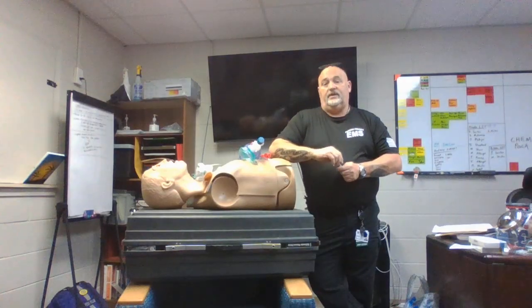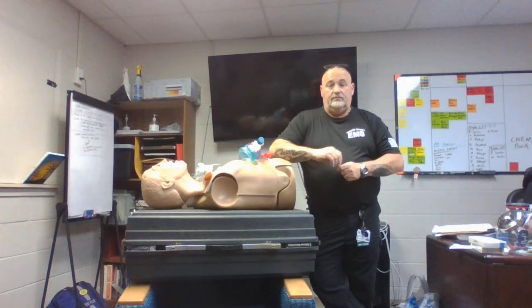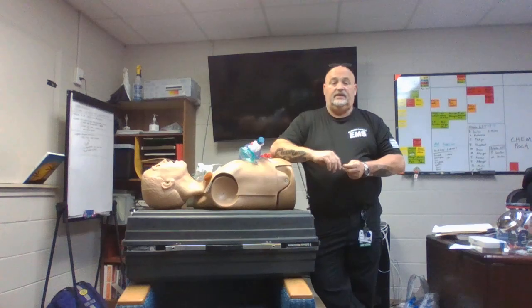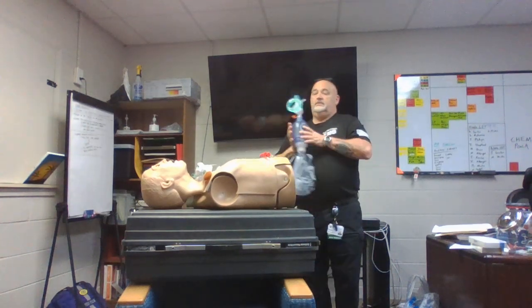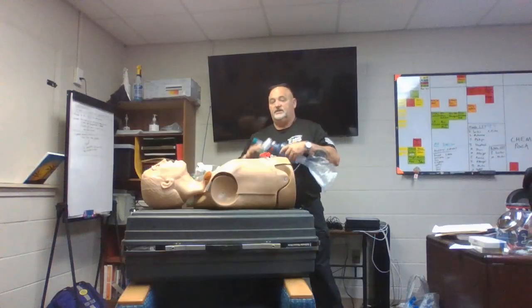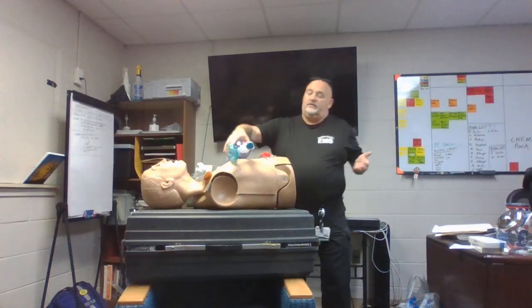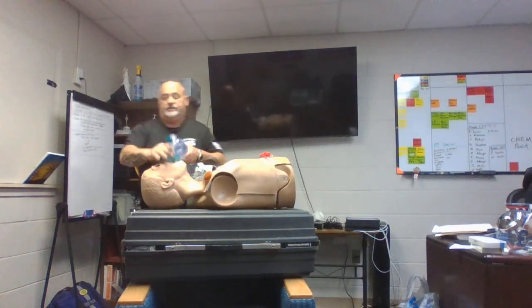And you have at least a better understanding of the adjuncts, when to use them, how to measure them correctly, proper use and placement of a BVM. Like I said, I probably hurt some people's feelings because the best way to do this is with two people. One holds the mask, they can pull that airway open, while the other one just squeezes the bag. If you've ever spent any time in an OR, the first thing they'll do is smack your hand if you go in there like this.